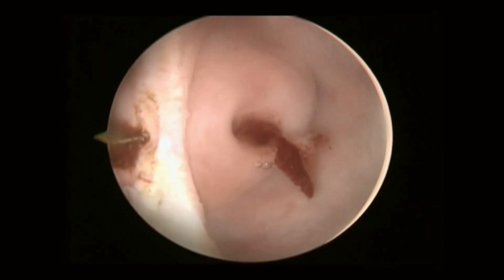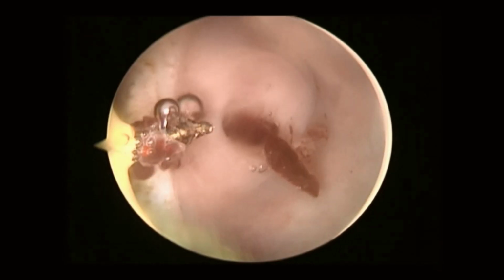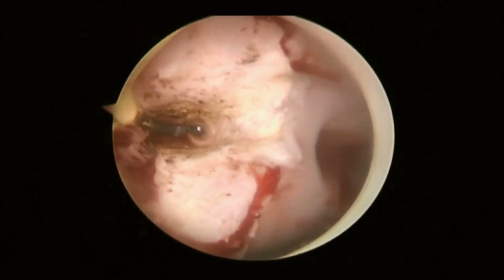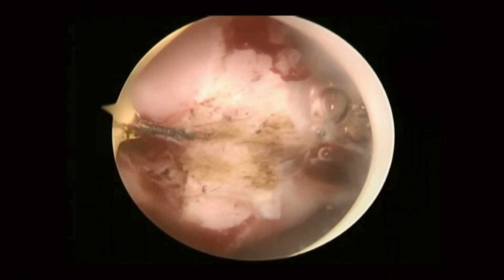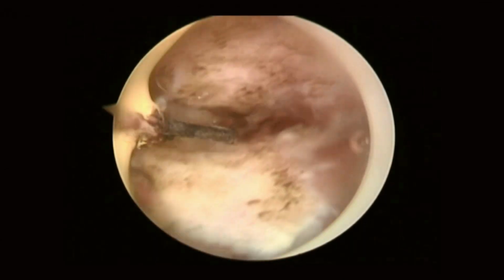Once you reach the cervix, you can take the pencil cautery, or the same monopolar cautery or bipolar hook, and you can cut the portion in between the two cervices. These patients typically need os tightening because the os is too patulous, so you need to remember that such patients should be offered os tightening in future.